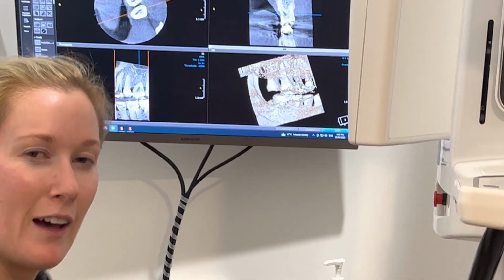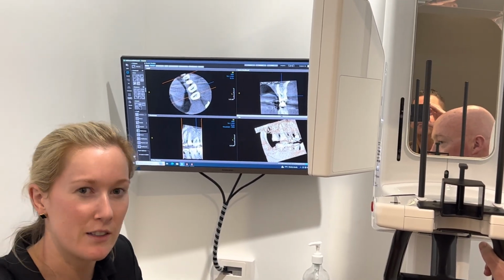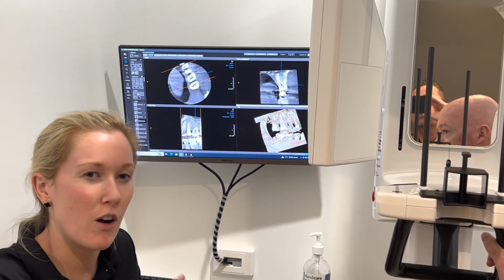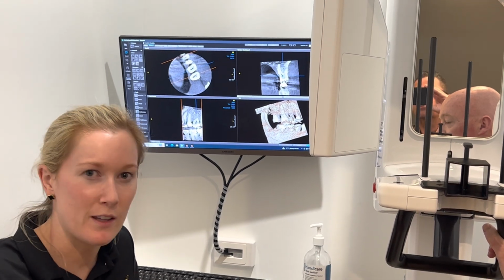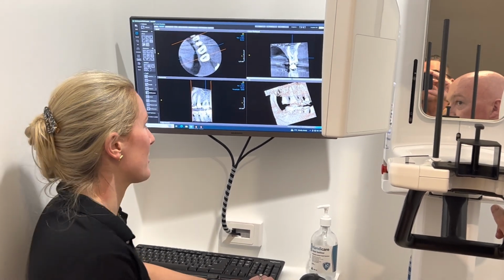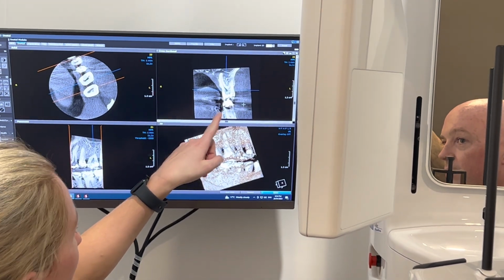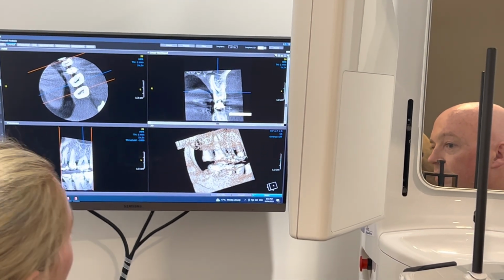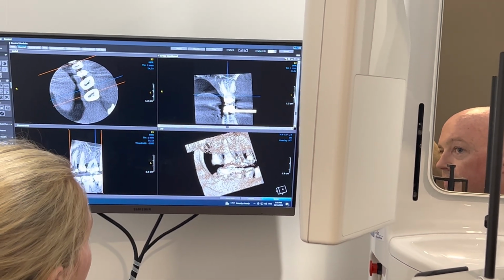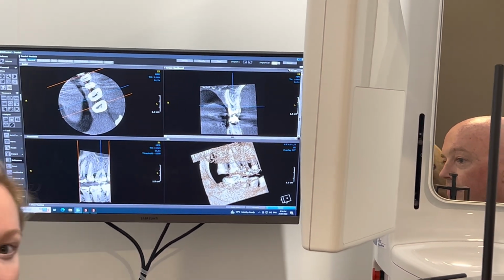Yeah, for sure. So we had a patient in. He had a few months where he thought he had some sinus issues, and finally he shows up at the dentist. It wasn't obvious as to which tooth or where his pain was coming from. So I ended up taking a CBCT. Thank God we have this one. Once I got in there, you can see quite a medium to shallow filling, but actually you can see a huge abscess off the ends. You've got on the mesiobuccal root and on the palatal root a huge abscess sitting just below the sinus.